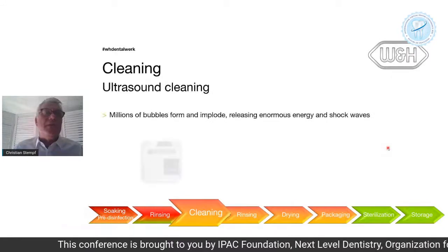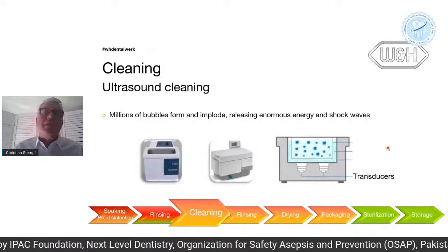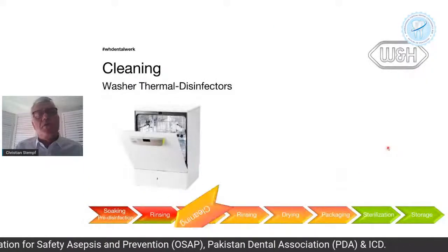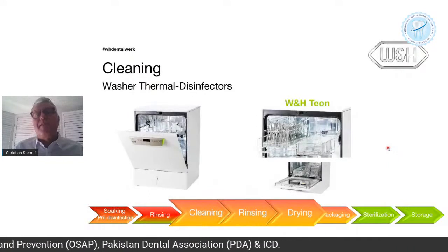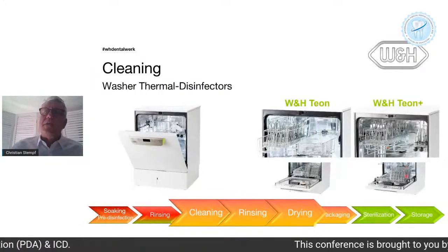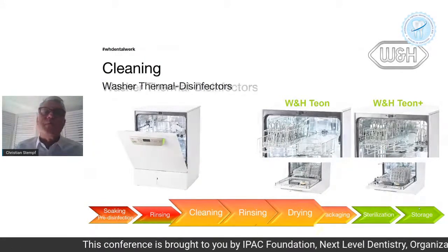This is, for me, the second best, ultrasonic cleaning, as has been said before. And this is the top, thermal washers. Of course, it's expensive, but this guarantees the best cleaning. These machines last for 15, 20 years, so it might be a smart investment.